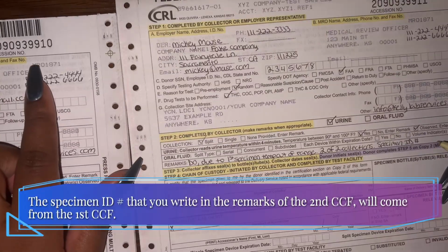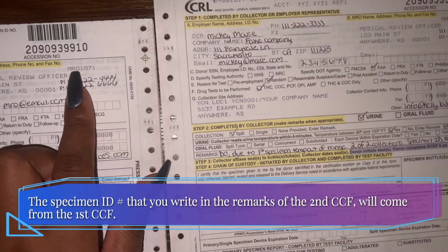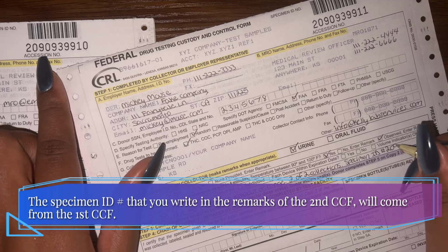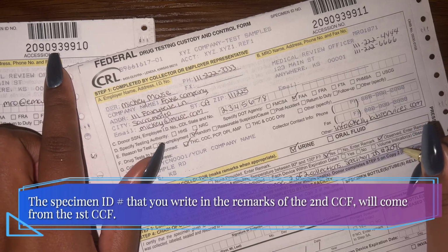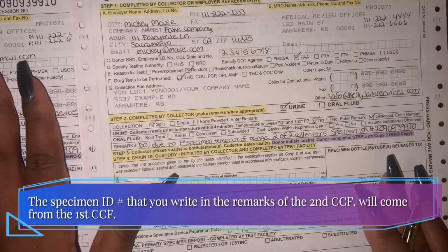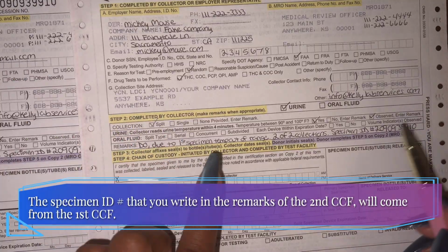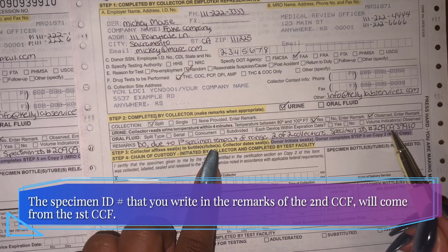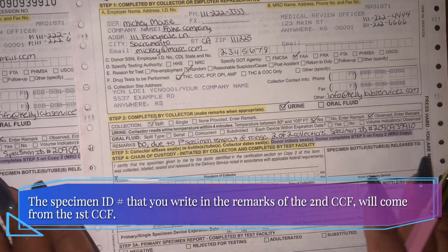So that number we're going to take off is 209,093,9910. That's going to tell them that there is another specimen that was temp out of range. This is the ID number for that specimen. They need to reference each other.